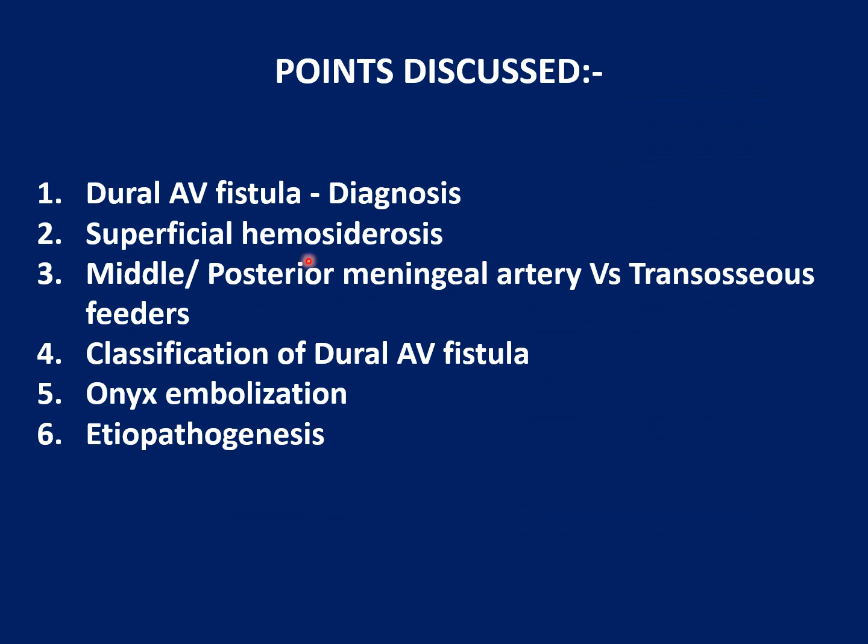So basically we have discussed dural AV fistula, superficial siderosis, middle and posterior meningeal arteries versus transosseous feeders, why we prefer middle meningeal arteries, the classification of dural AV fistulas, ONYX embolization and etiopathogenesis.